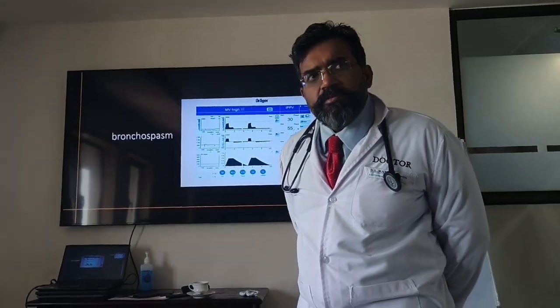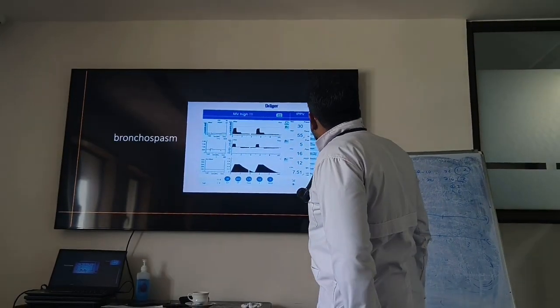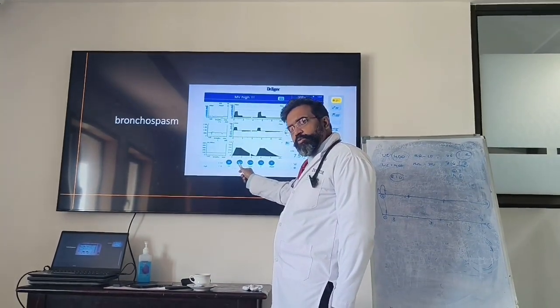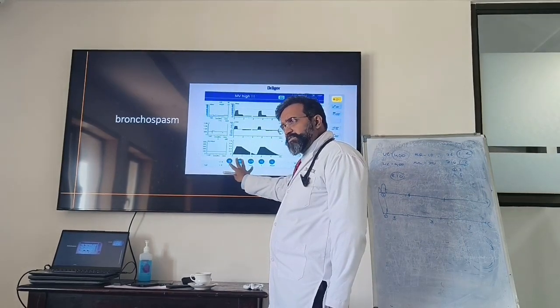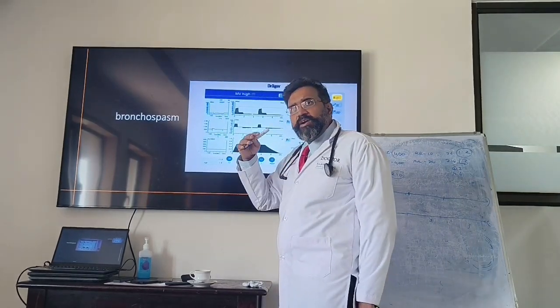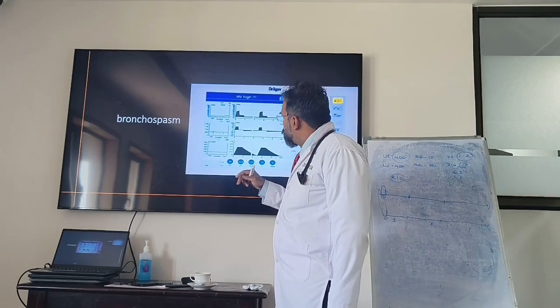time. Limited by volume, because I've set the tidal volume here. I've set a tidal volume, so it's limited by volume. 623 volume लगा के रखा है हम लोग ने. हाँ, volume is set. So it is a volume limited, time cycled form of ventilation. Right? Cycling means conversion from inspiration to expiration. Cycling. Okay.